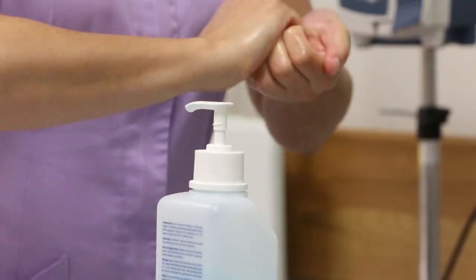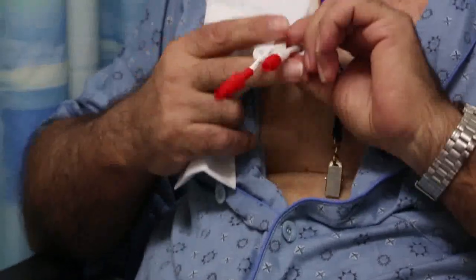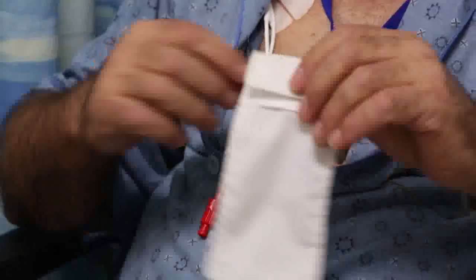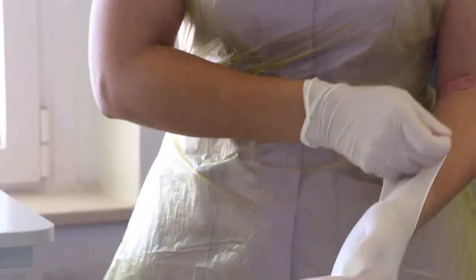Identify the patient and explain the procedure. Expose the patient and line appropriately, allowing comfortable access. Wear the apron. Put on non-sterile gloves.